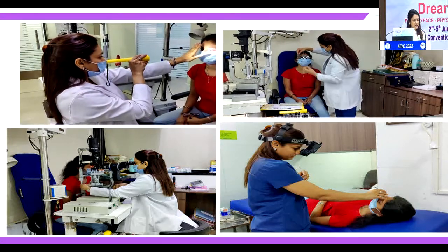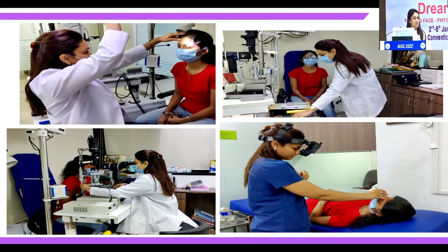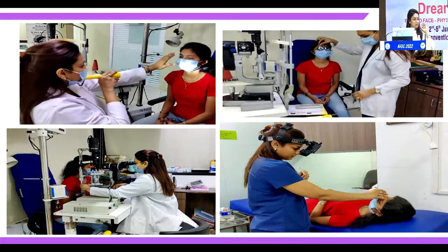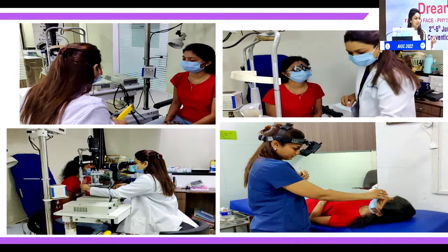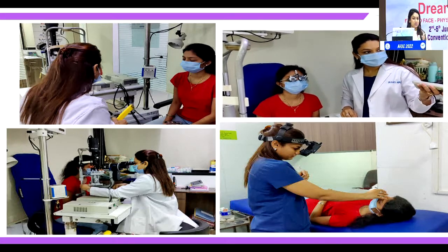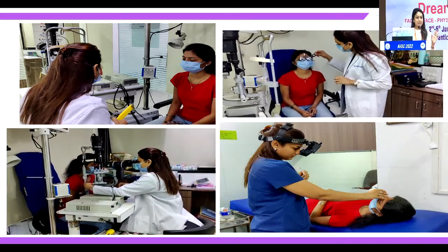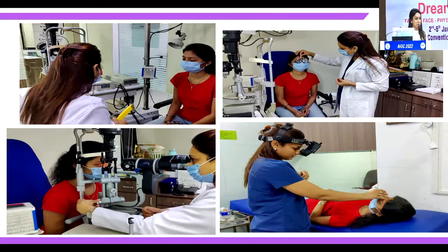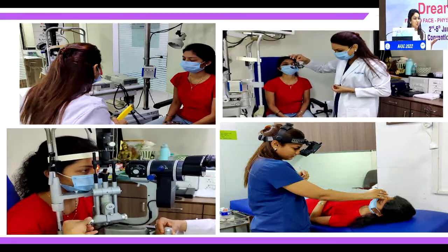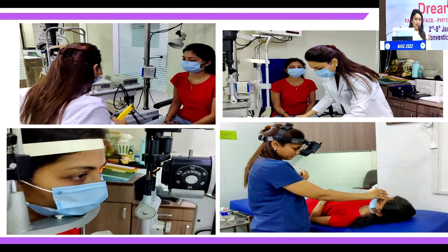Very, very, very important in any refractive surgery is to do your own refraction. This is one thing which will really take your refractive practice a notch higher. Do your undilated as well as your cycloplegic refraction only by yourself, and do not trust any optometrist. A good slit lamp examination to rule out if there's any cataract is one of the very important things to document. Of course, along with cornea, how clear it is, and the anterior chamber and other details of the eye.